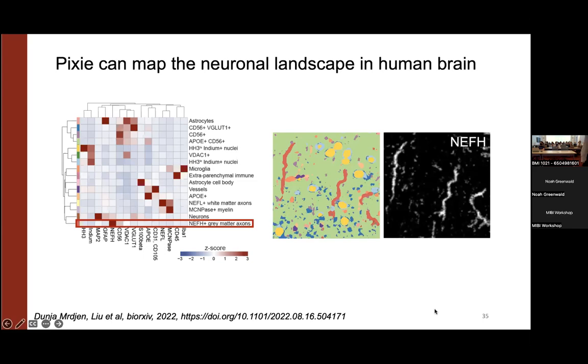That's this red pixel cluster here, the red squiggly lines. It is reflective of the actual MIBI image. And it's such a weirdly shaped thing that would definitely not be captured using our current cell segmentation method.